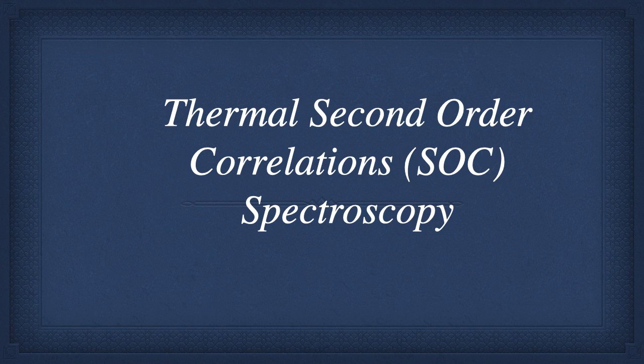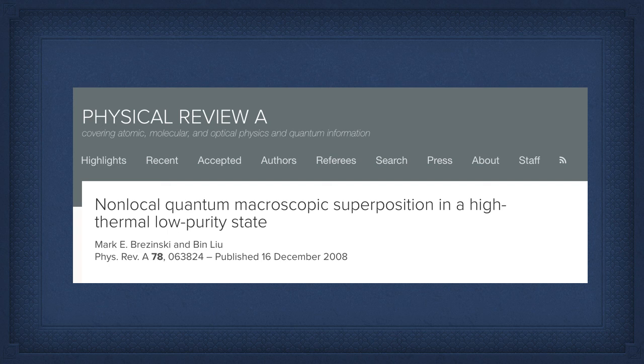They can exhibit these entanglement-like processes, and these were being filtered out by the OCT system. But what they can give you is, again, information inside the tissue unaffected by the tissue that they pass through, quantum mechanics.